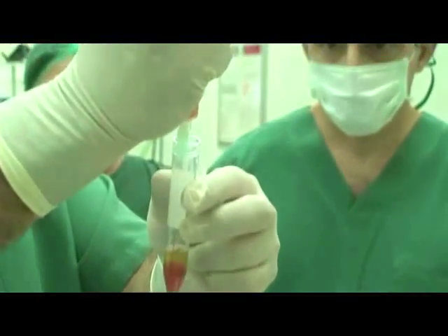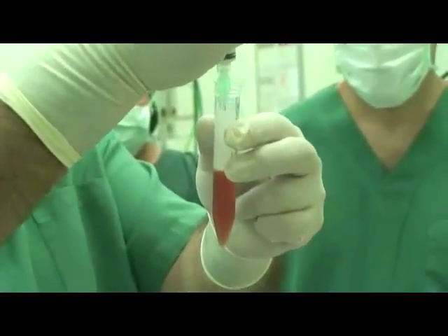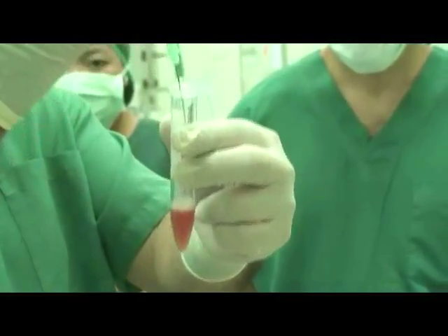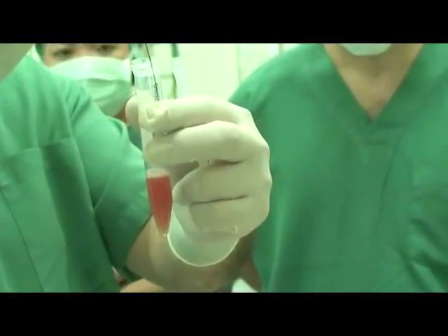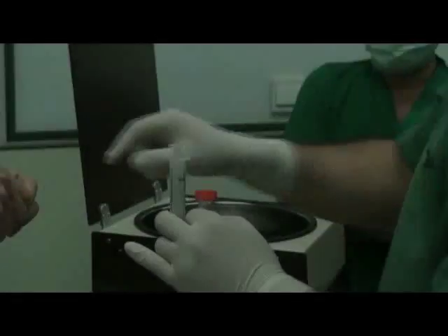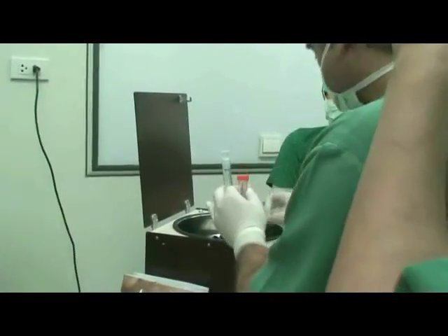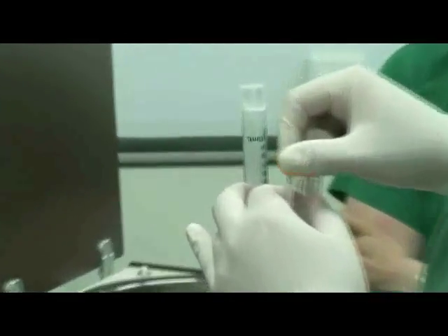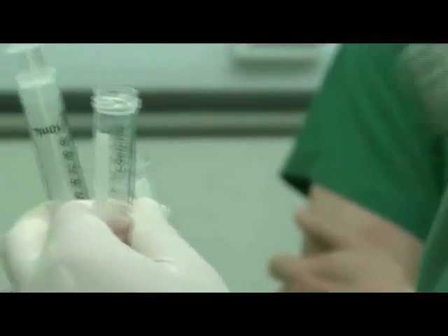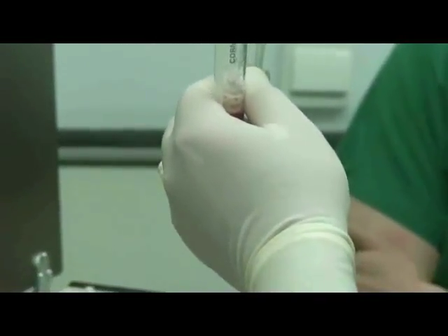Using a spinal needle, reconstitute the liquid and add the contents of one tube to the other. Draw out 2 milliliter of the ADDI-STEM calcium activator into a syringe and inject it into the tube filled with PRP liquid.